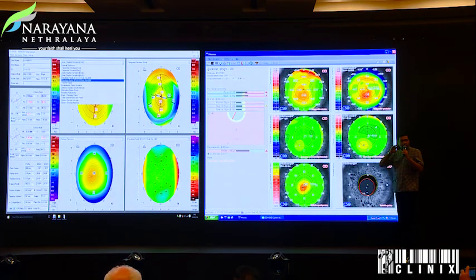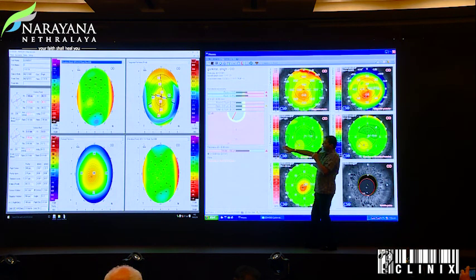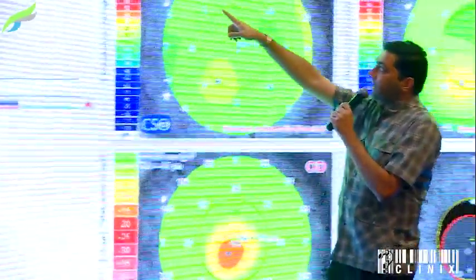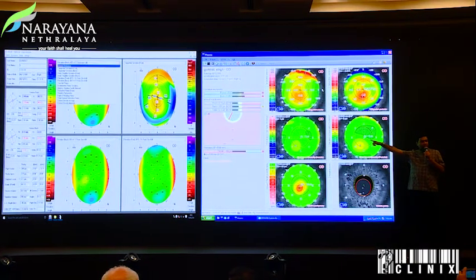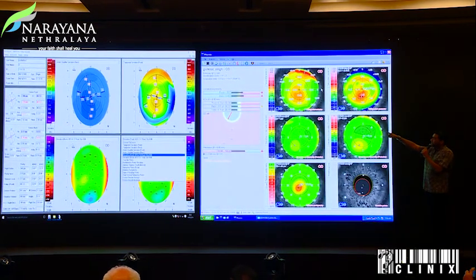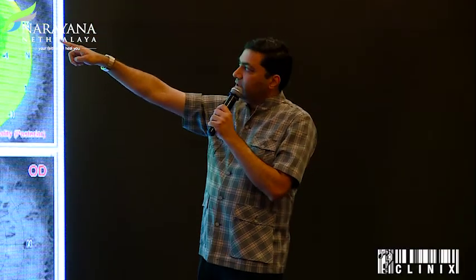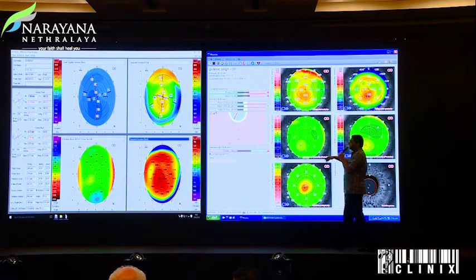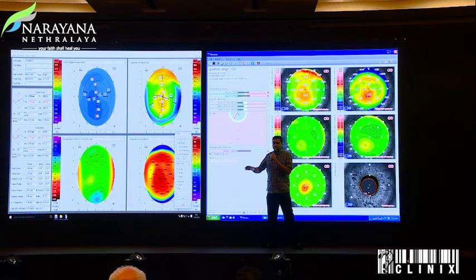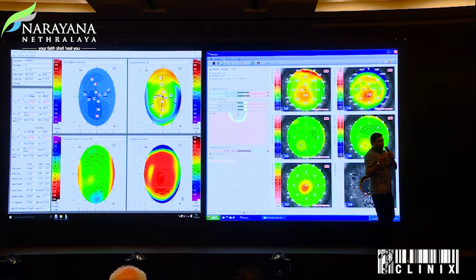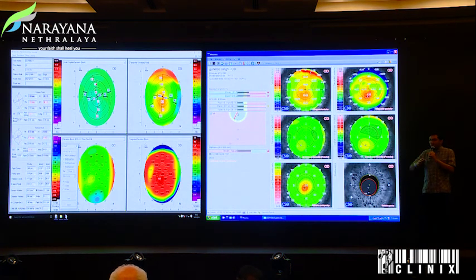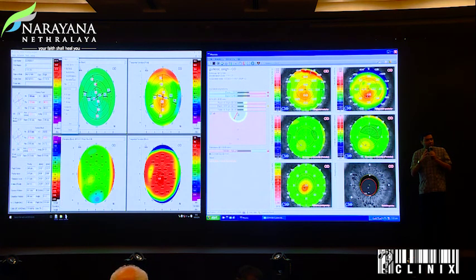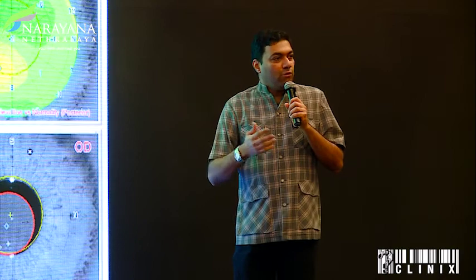One of the things for the Sirius user is, I like this map. If you really look at this map — I don't know how many of you use it in your refractive screening — it's called the curvature symmetry, the front and the back. You get the BCV, which is front and back, and you get the composite graph. It looks like they want to give you a quick visual so you are able to pick up one thing very fast. So it may be a good screening tool for your optometrist or yourself.